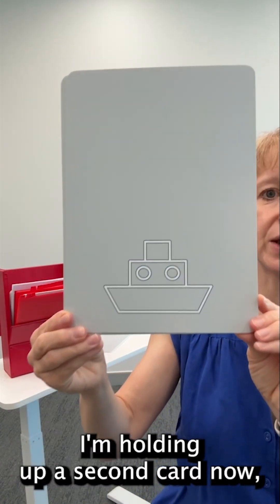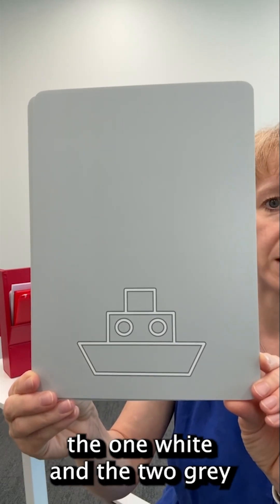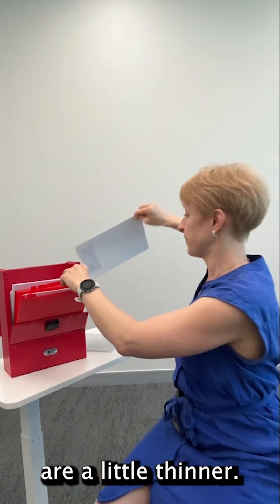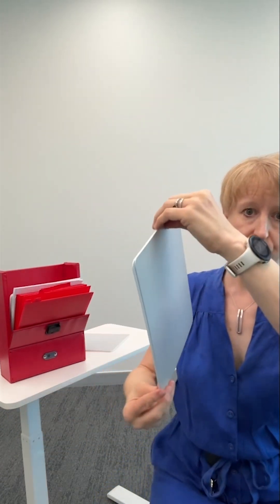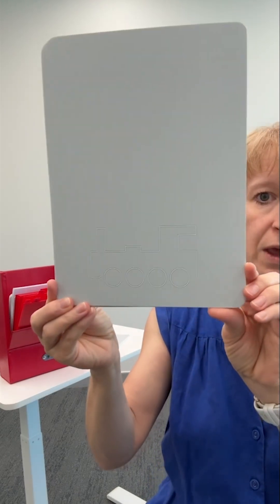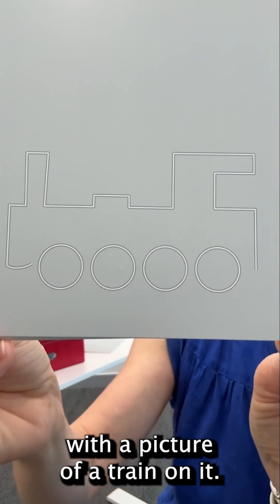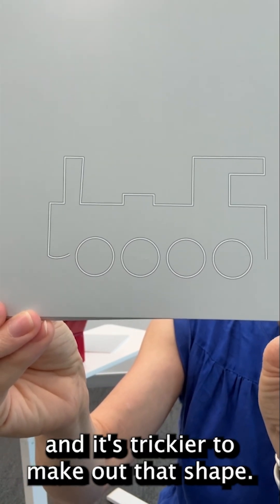I'm holding up a second card now and this one has a picture of a boat. Compared to the apple, all three lines — the one white and the two grey — are a little thinner. And now I'm holding up a card with a picture of a train on it. Again the three lines are thinner still and it's trickier to make out that shape.